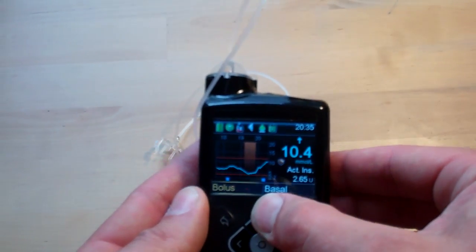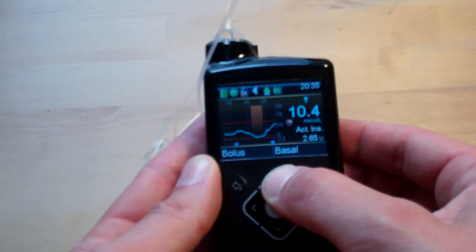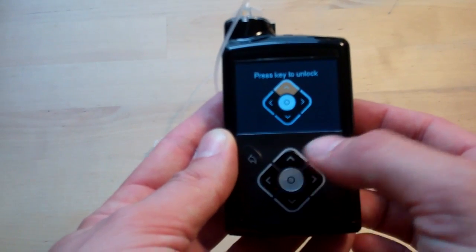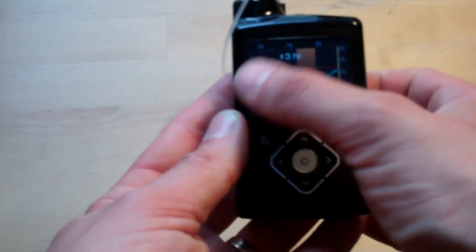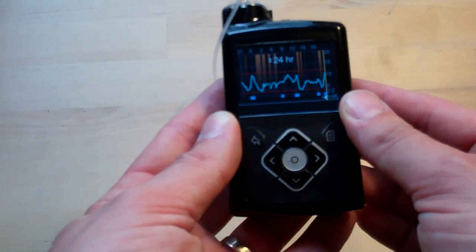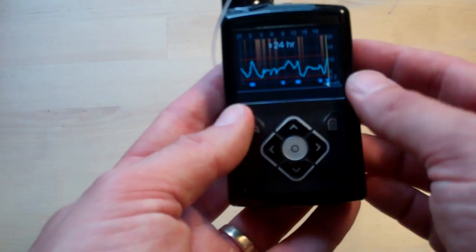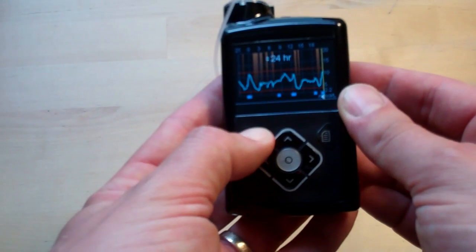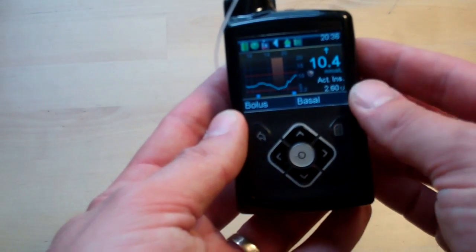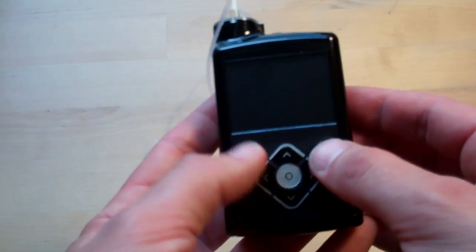Also available from the home screen, you can drill into each section using the 5-way controller — 4-way plus OK. As you move up and down it highlights different parts of the screen. If you highlight the sensor trace and click OK, there's your 3-hour trace and you can scroll back all the way to 24 hours. And one nice touch: if you're deep within some menus and just want to leap back, press and hold the back button and it bounces you straight to the home screen. Press and hold the menu button and it puts it in sleep mode.